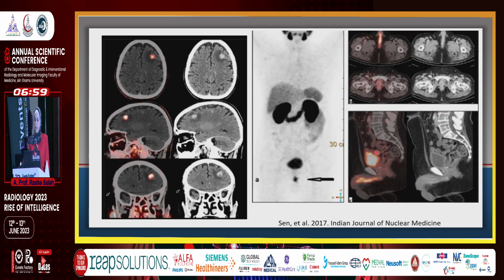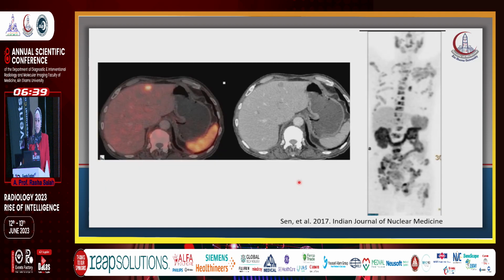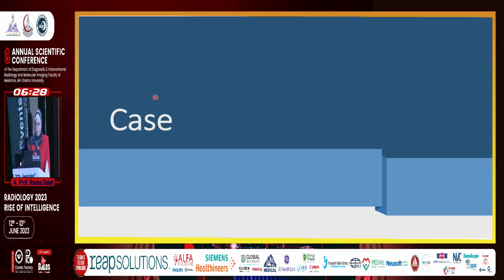This patient has prostate cancer, and it was surgically removed, and then the patient came again with biochemical recurrence, and unfortunately there was a brain metastasis located here, and it shows a significant PSMA uptake over here, with also a small recurrence at the operative bed over here. This is another example for a patient with liver metastasis, although it is not common for the prostate to have hepatic metastasis, but this patient has this hepatic metastasis.